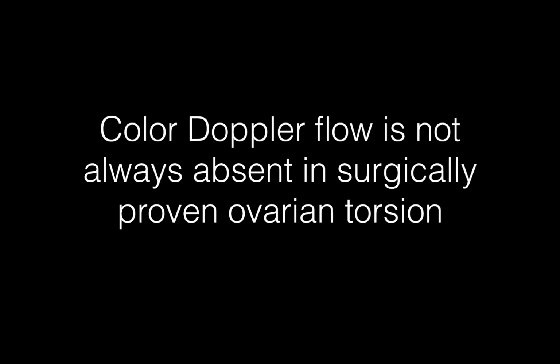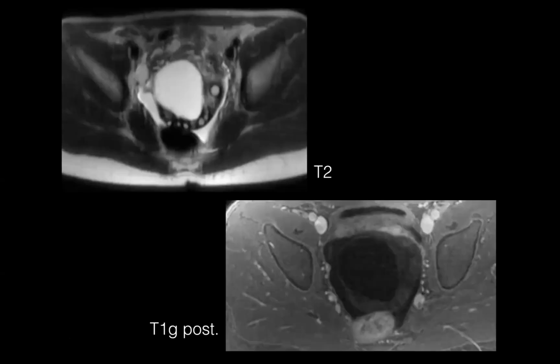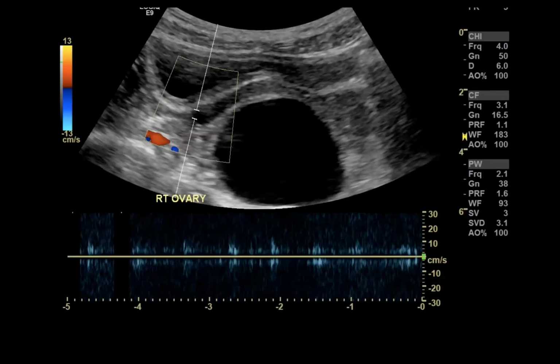Could you explain what the bottom ultrasound plot was showing? Oh, yeah. So we'll go back to this. Here there's a little gated area, and in this area, this is looking at the Doppler shift of the ultrasound signal over time. So this horizontal axis is time. That Doppler shift is converted to a velocity, so you're seeing the velocity of blood flow there.